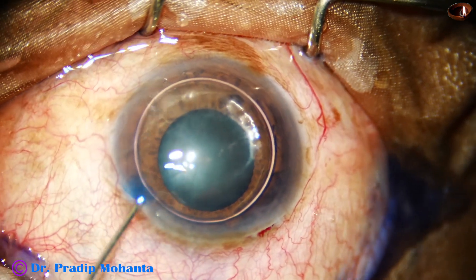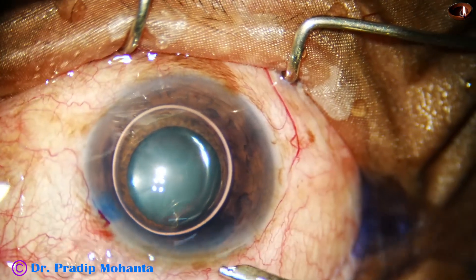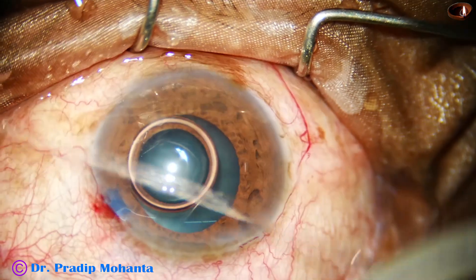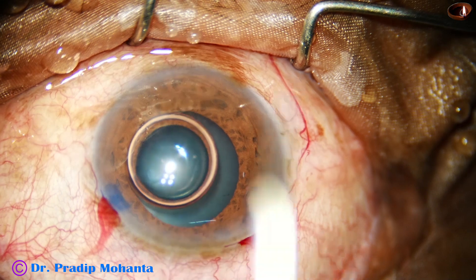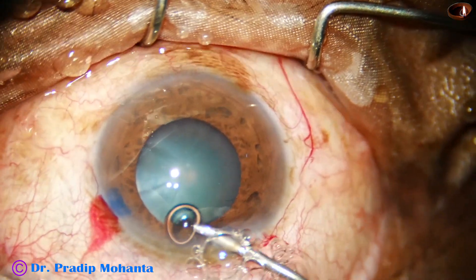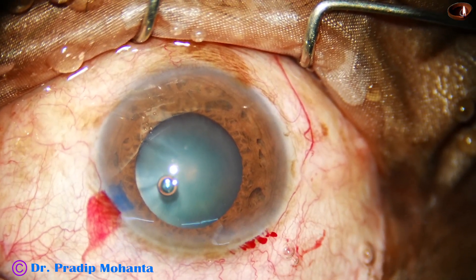This is a little bit of adrenaline. At this time we see that the pupil size is about 4.5 to 5 mm. With viscoelastic substance it can go up to 5 mm. We may think at this stage that it will be easy to complete the case without any pupil expansion device, but during chopping and during emulsification the pupil shuts down and becomes very difficult to manage. This is the B-Octa 8.00 pupil expansion device.